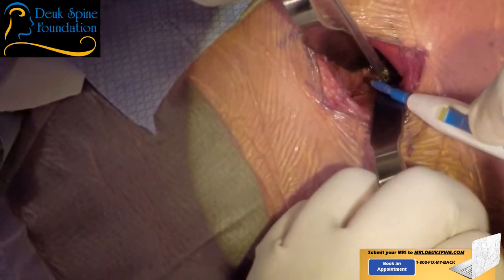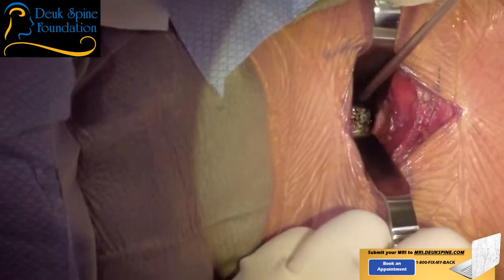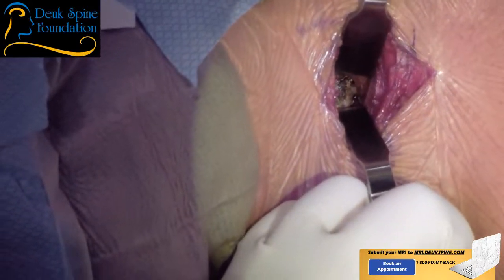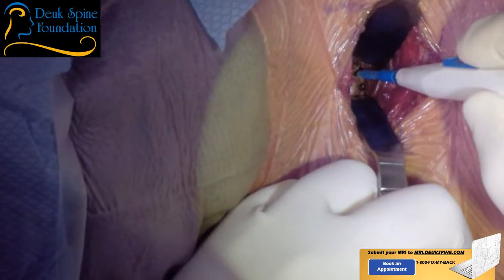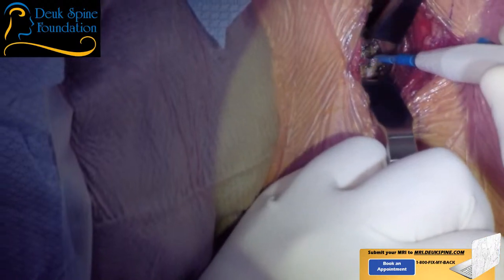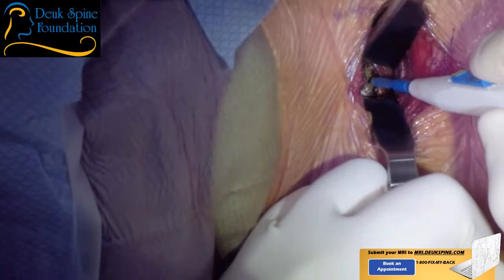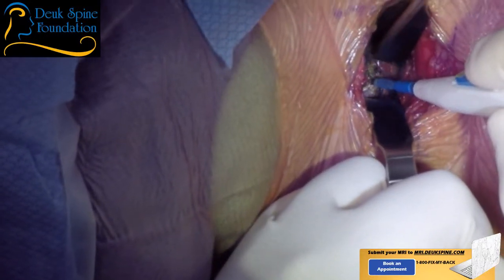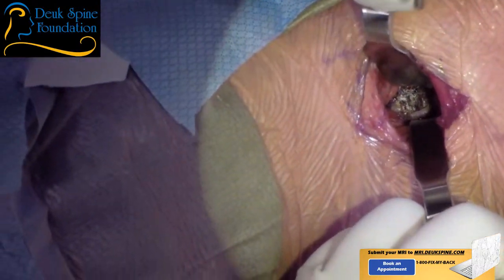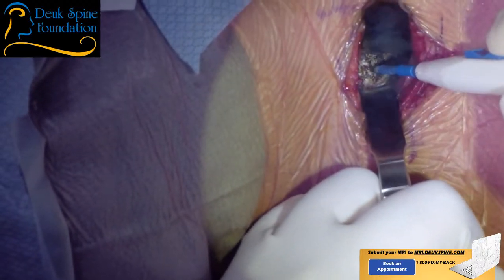So Dr. Patel is retracting the esophagus. Can you all see this here? This thing here is the esophagus, okay? The swallowing tube. And surgeons screw up with that all the time, okay? I had a patient come to me that had an ACDF done at a surgery center down south, and the surgeon cut through his esophagus while he was opening the spine, getting down to the spine, doing the exposure. And the worst thing about it was the surgeon acknowledged that he cut through the esophagus, and then he told the patient to go home, which you never do. That's an emergency. You have to admit the patient to the hospital.